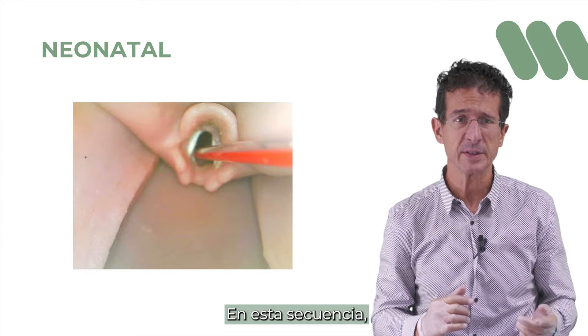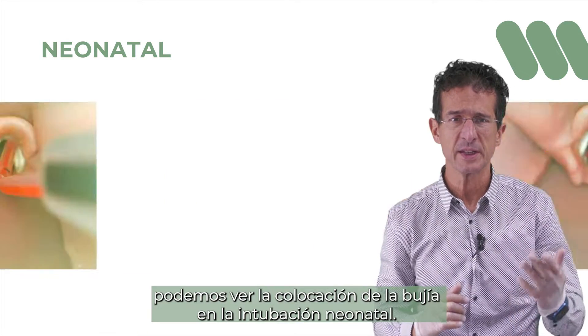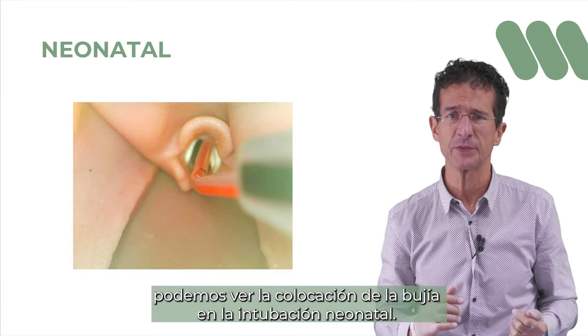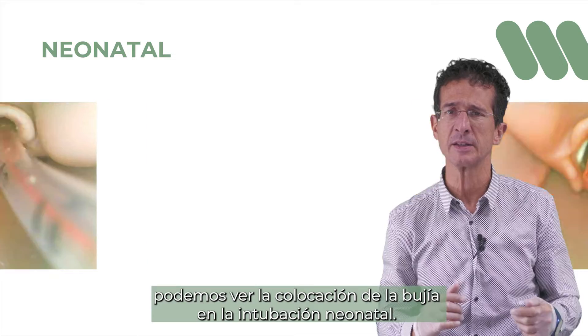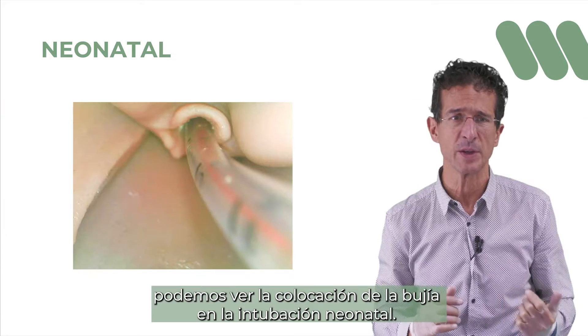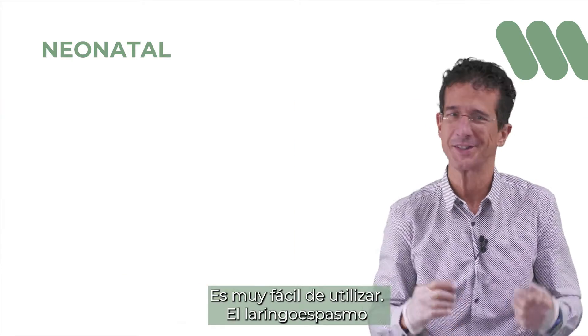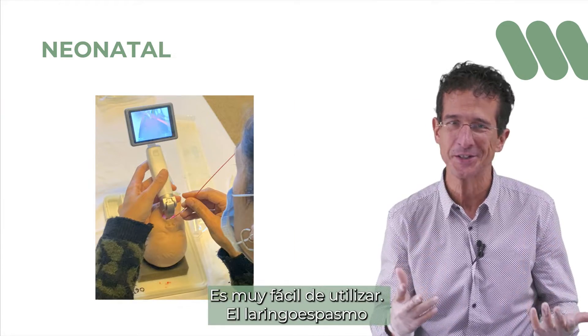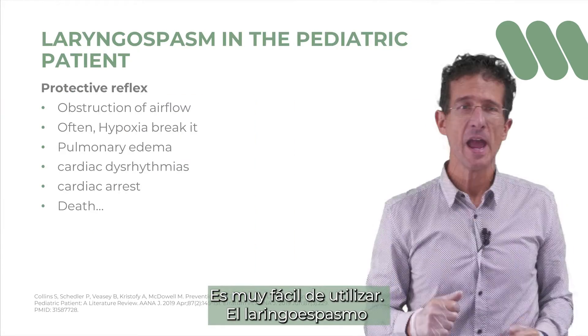In this sequence, we can see the placement of the bougie in neonatal intubation. It is really easy to use.